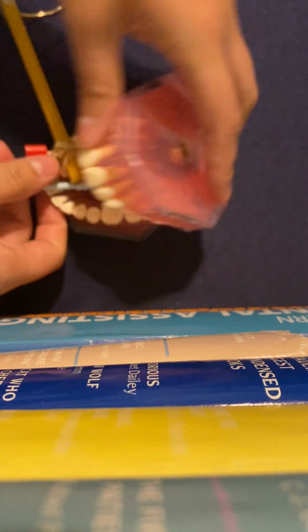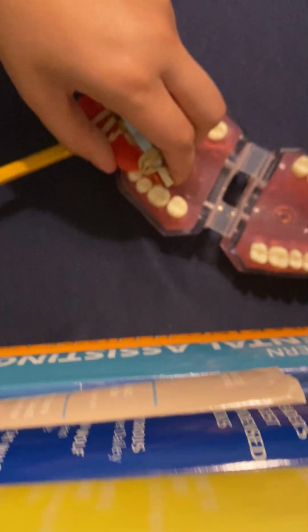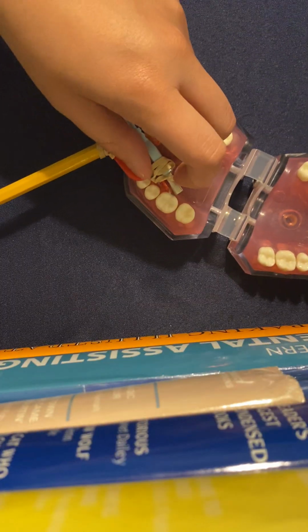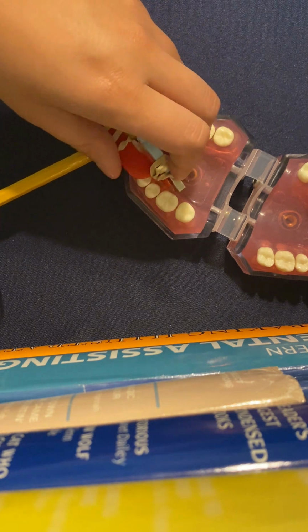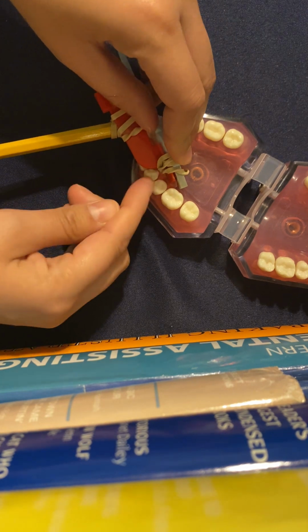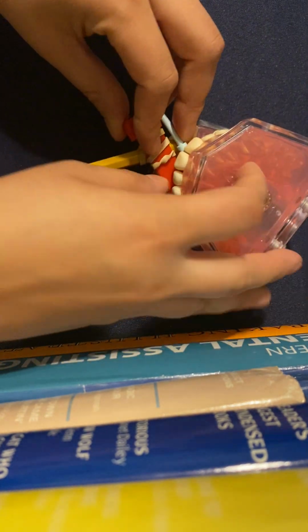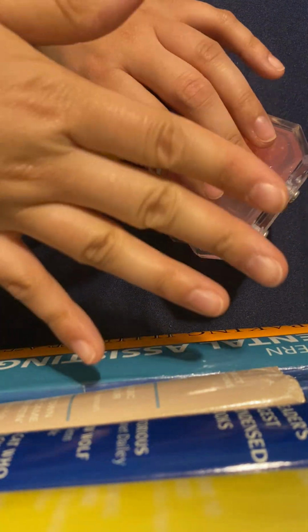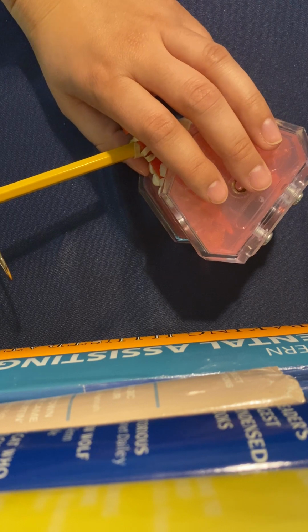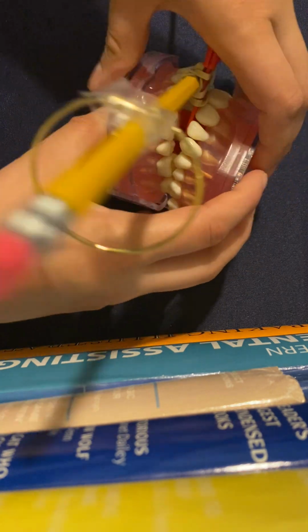Now we are going to do the bite wing, the left premolar side, and you don't have to change this up any for that, which is quite nice. So there you go, focus in. All right, so you're going to place the anterior edge at the middle of the mandibular canine. Get between those right there. You want the sensor in like that. The teeth and the areas that you're going to want to see are the distal of the maxillary and mandibular canine, premolars, and first molar in the occlusion. Pick it up.